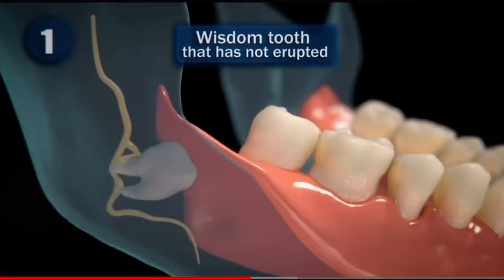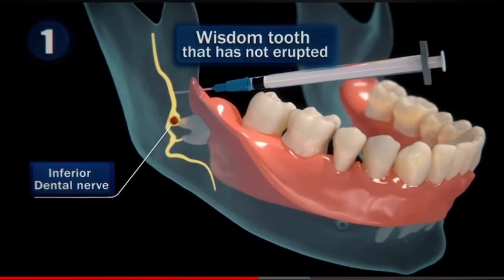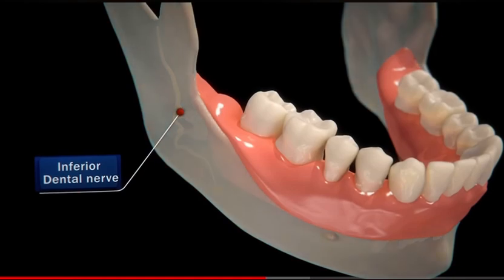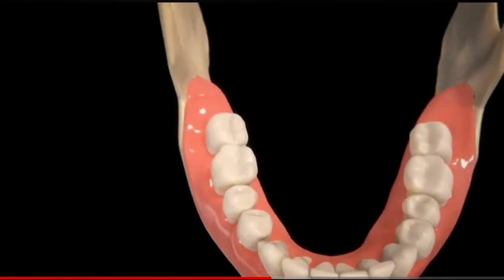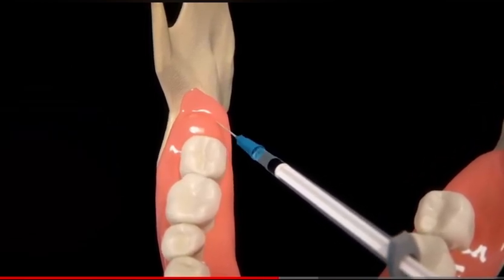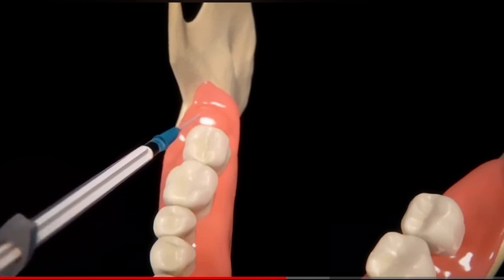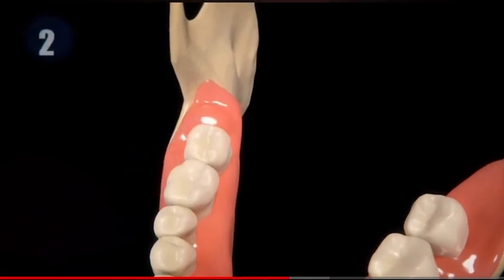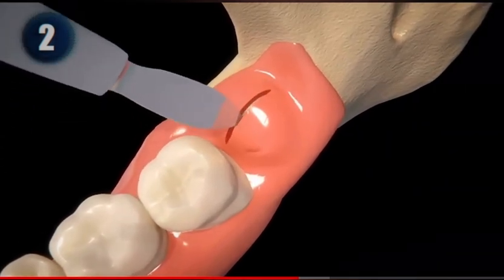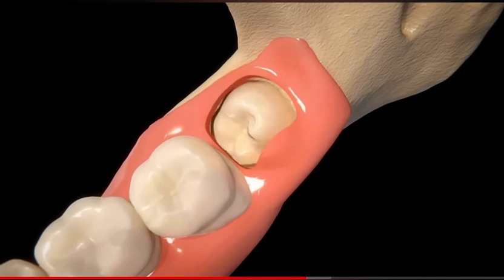To extract a wisdom tooth that has not erupted, the dentist will perform a nerve block technique to the inferior dental nerve in the area where the anesthetic will be applied. After one minute, when it has taken effect, the expert will proceed to anesthetize around the tooth with the help of an injection. Once it has been verified that the area is completely numb, a small incision will be made in the gum tissue to expose the bone that covers it and visualize the wisdom tooth.